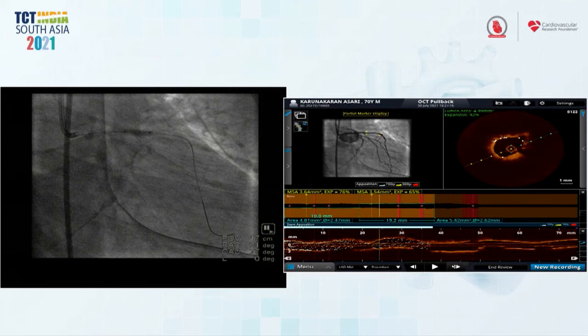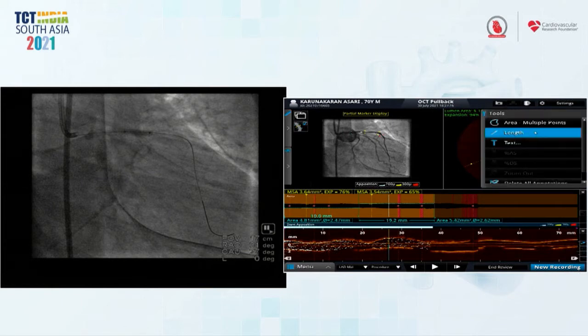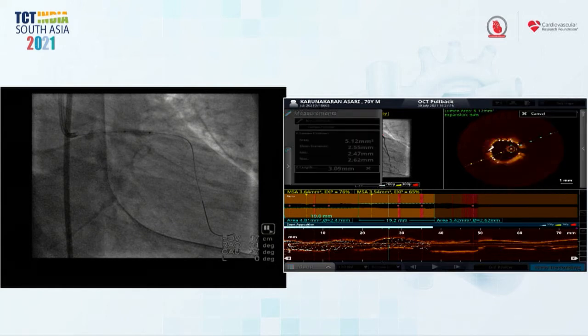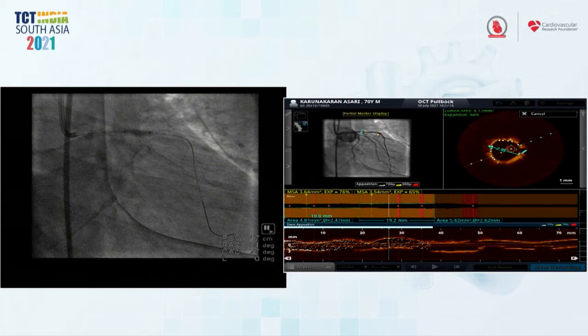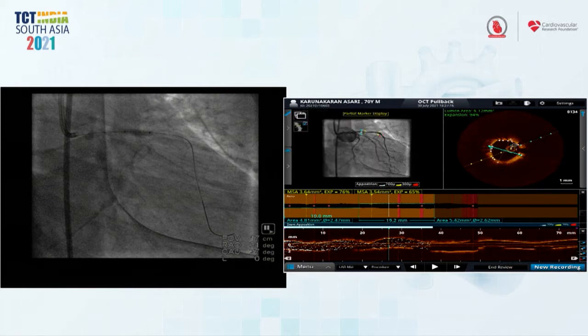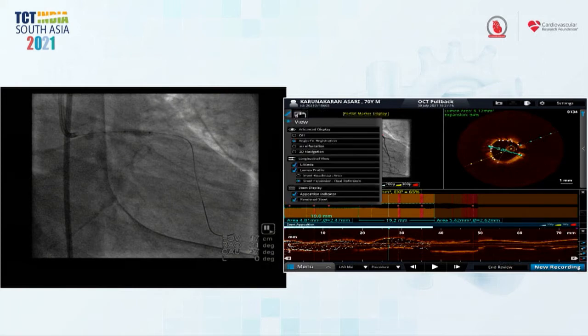And if you can't, you're absolutely right, I would use the IVUS to size how big a balloon I could use. Yeah, I was going to say that. As much as I love OCT for stent failure, in heavily stented vessels like this where you can't see deep wall structure, there is value to IVUS for understanding sizing. In a male, 3.0 in that segment of the LAD seems like, just by gestalt, it was small. So I'd be looking for any excuse to take a 3.5 there, and I think the IVUS could help you with that decision.